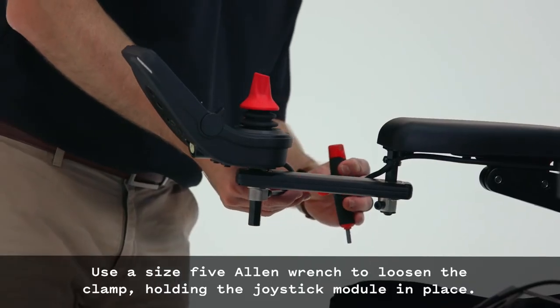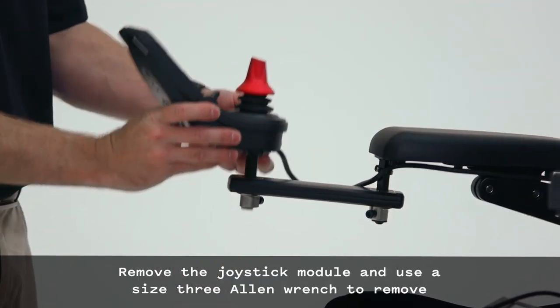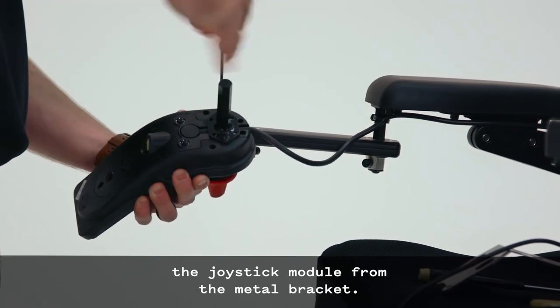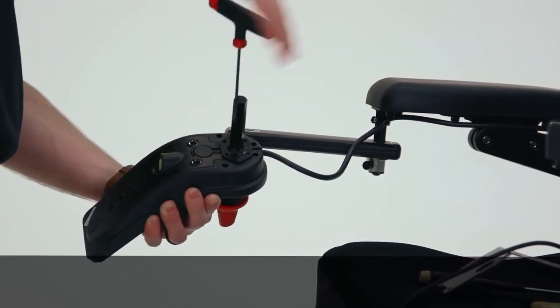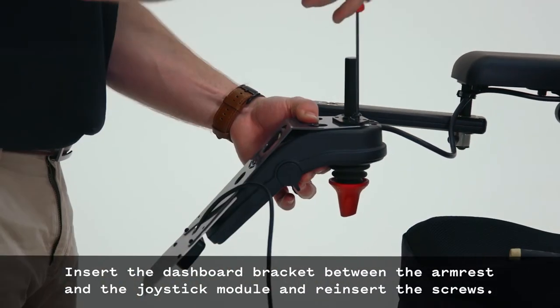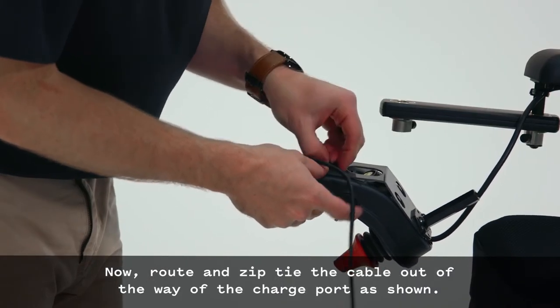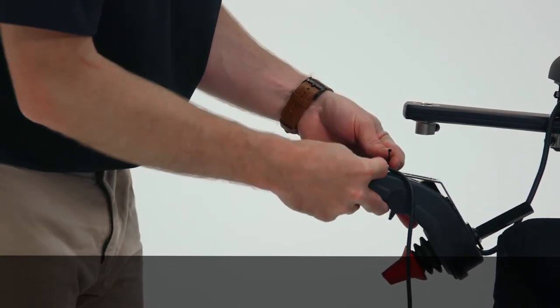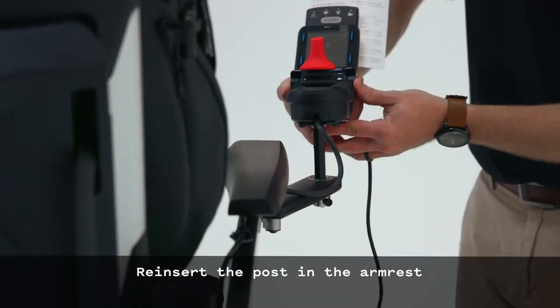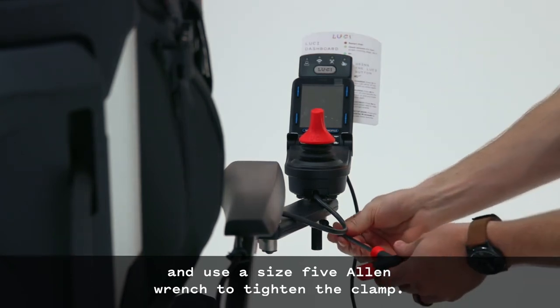Use a size 5 Allen wrench to loosen the clamp holding the joystick module in place. Remove the joystick module and use a size 3 Allen wrench to remove the joystick module from the metal bracket. Insert the dashboard bracket between the armrest and the joystick module and reinsert the screws. Route and zip tie the cable out of the way of the charge port. Reinsert the post in the armrest and use a size 5 Allen wrench to tighten the clamp.